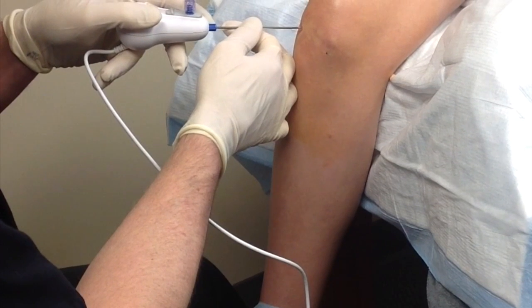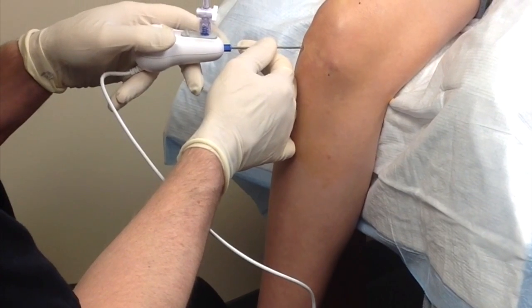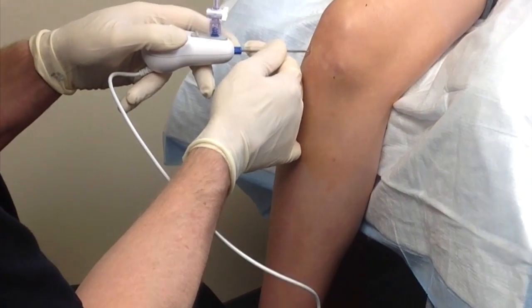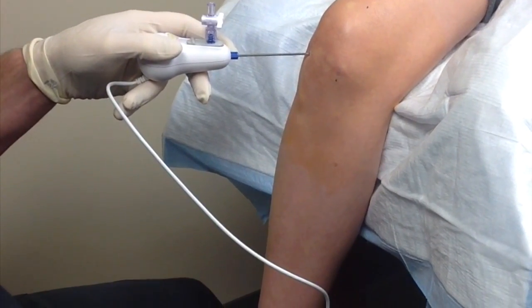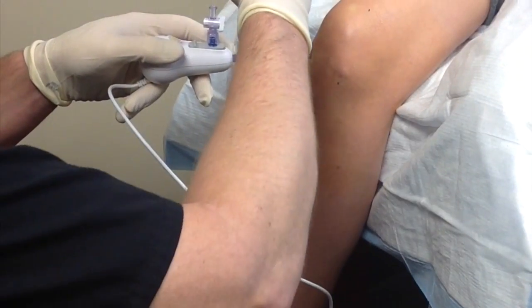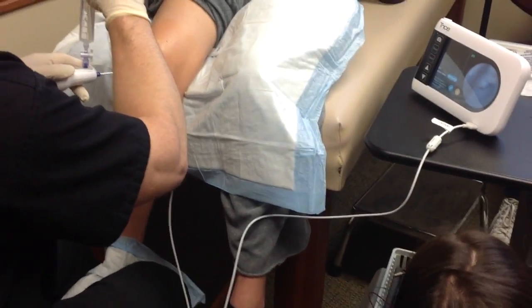This has a needle sheath, and contained inside is an arthroscope. We numb up the patient's knee at the sites where we plan on entering it, as well as the interior of the knee. On top of the device, you'll see a portal that I'm going to attach a syringe of saline to, which allows us to push saline into the knee and get an inspection of the joint.